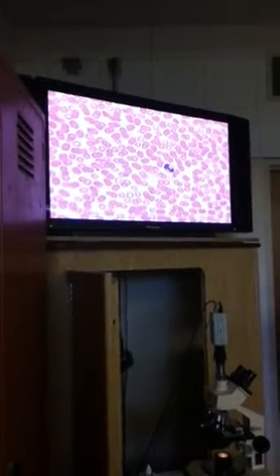It's big. Eosinophil, I think it's that. Orange too, as well, in color. You think it's an eosinophil? Yeah, I think it's an eosinophil. Okay, good. Just want to make sure you can say it.